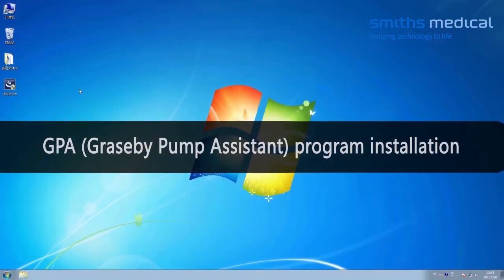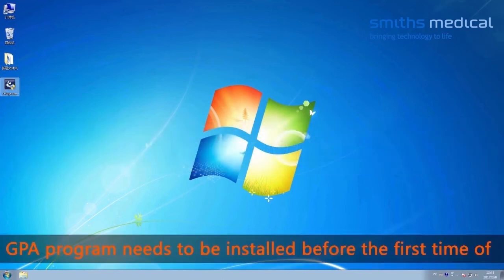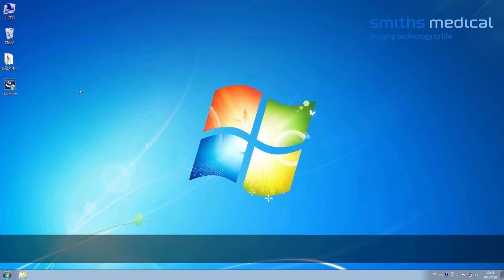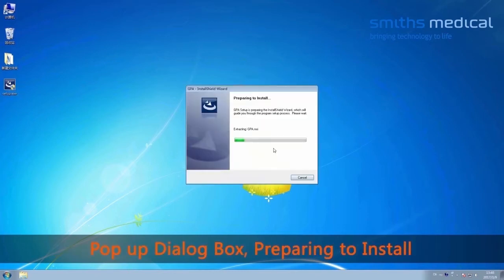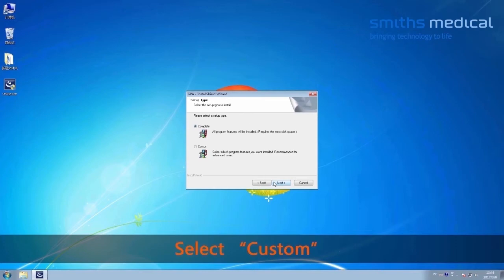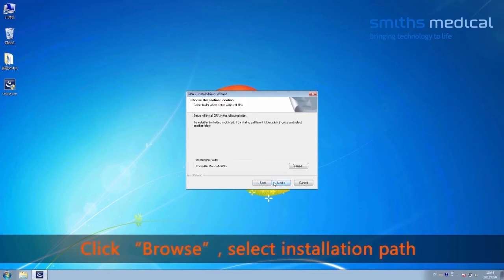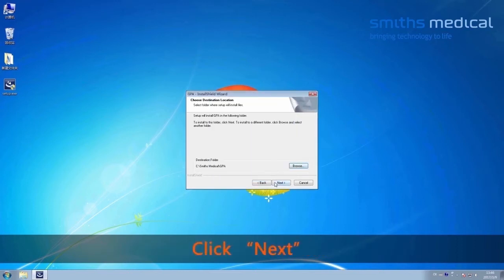GPA program installation. The GPA program needs to be installed before first use. Double-click the installation program setup. A dialog box will pop up preparing to install. Click Next. Select Custom. Click Next. Click Browse and select the installation path. Click Next.